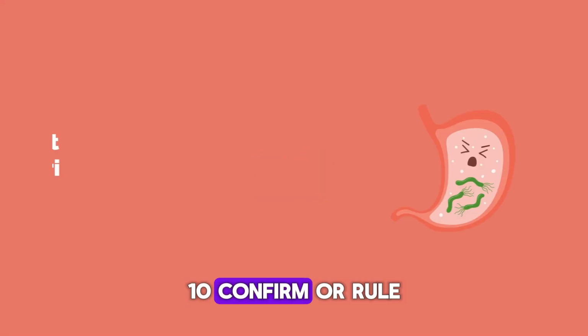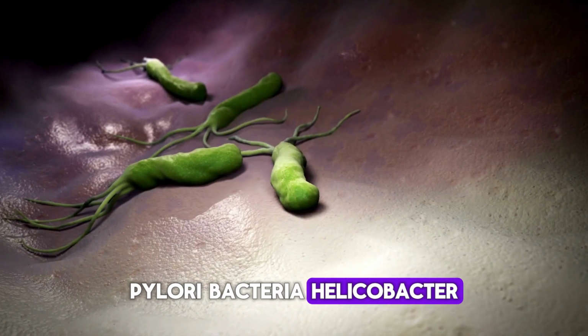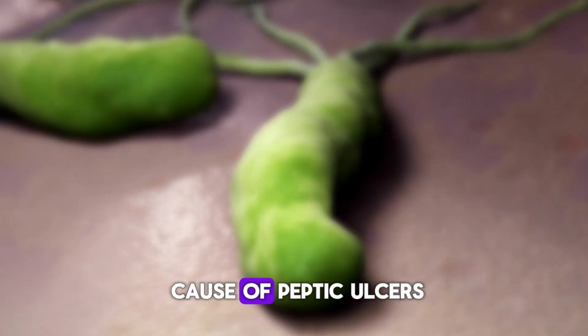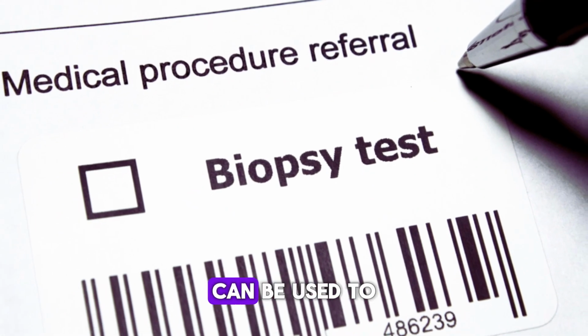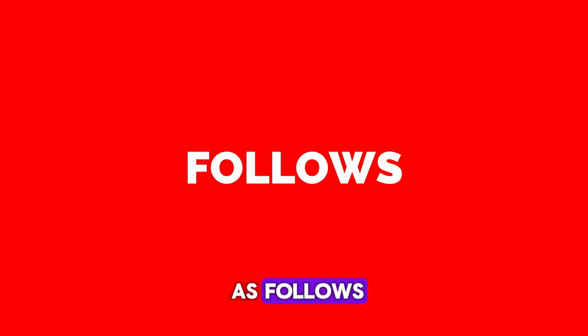10. Confirm or rule out presence of H. pylori bacteria. Helicobacter pylori is a type of bacteria that can infect the stomach and is a common cause of peptic ulcers. A biopsy taken during a gastroscopy can be used to test for these bacteria, helping to guide treatment decisions. The gastroscopy procedure is as follows.